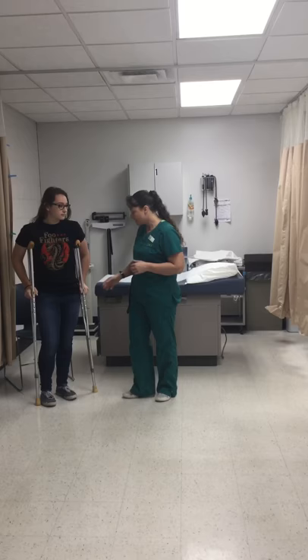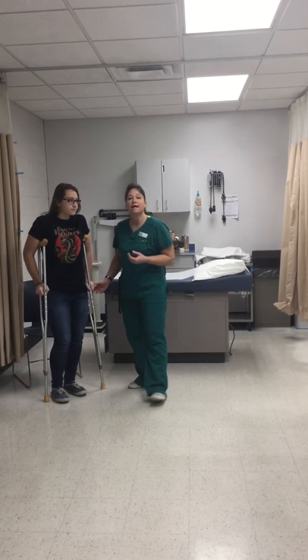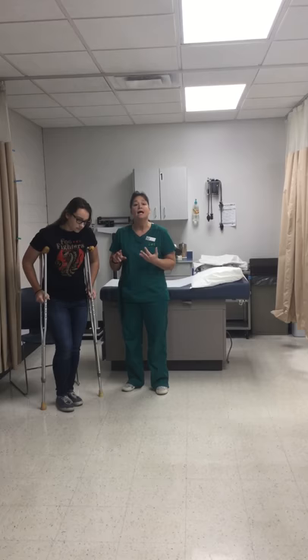Alright Erin, does that feel comfortable for your weight to be put on your hands? Now I want to give her a little bit of instruction now that I have the crutches adjusted to this particular patient. I want to tell her exactly what to do, how to go forward, where to put her weight, etc.